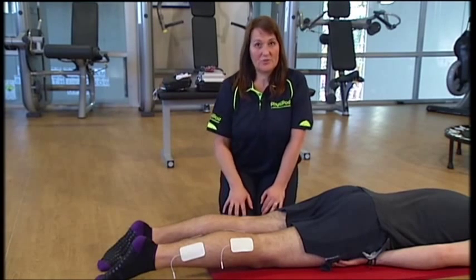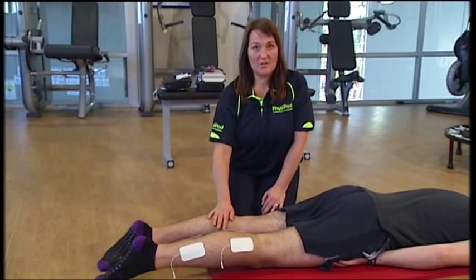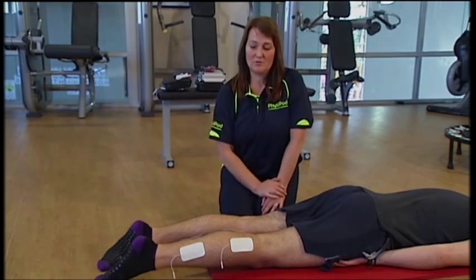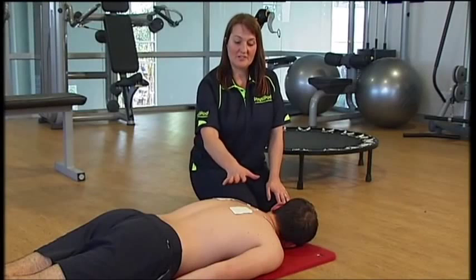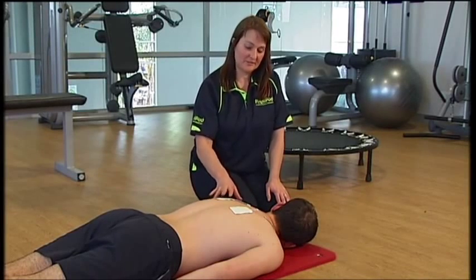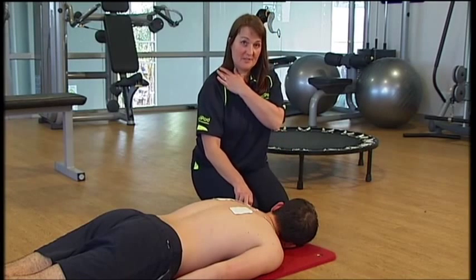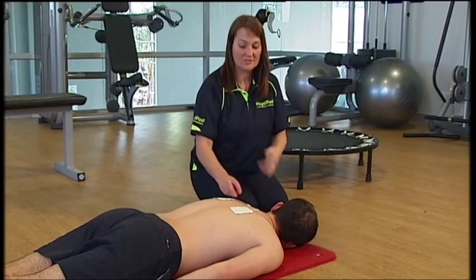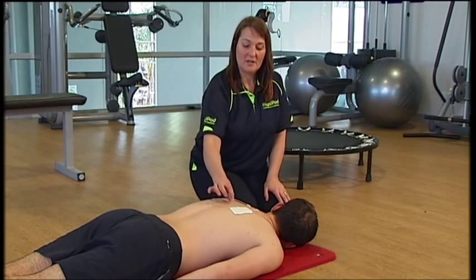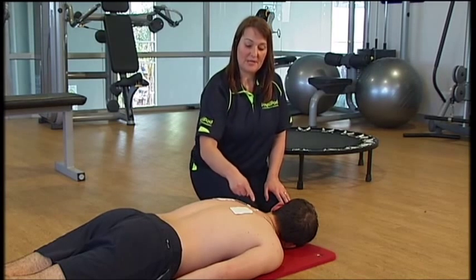Don't place the electrodes over an open wound. As long as the skin is clean and dry, you should be fine. If your skin is oily, you might need to pre-wash the skin before you put the electrode on. An ideal placement for neck and shoulder pain would be one electrode either side on the upper trapezius — that big muscle that's always full of tension — and two in the mid-thoracic area, not having the electrodes closer than five centimetres apart and circling the main area of pain.